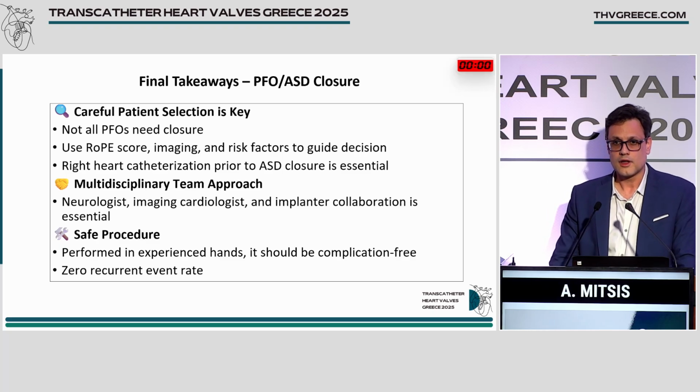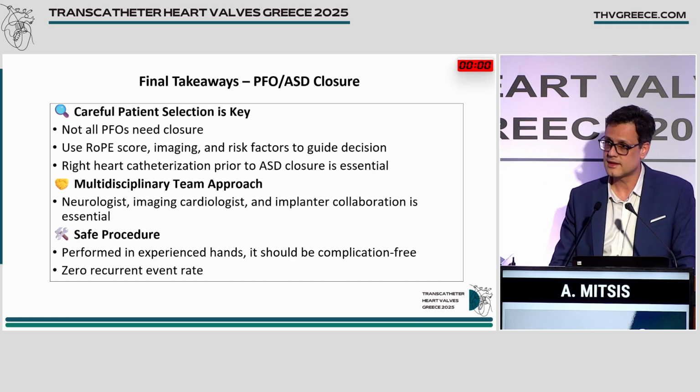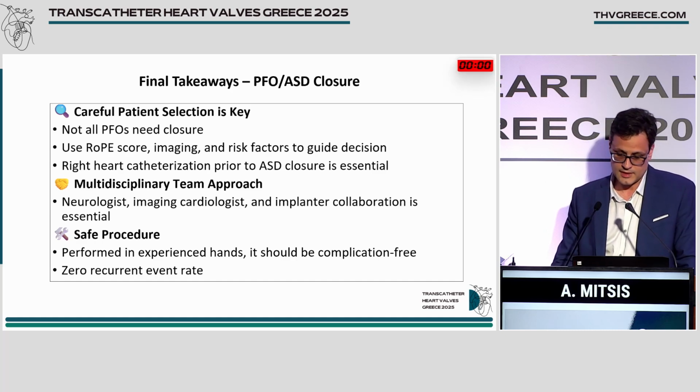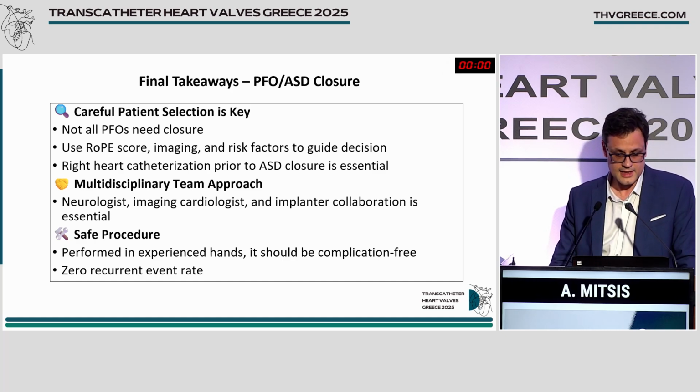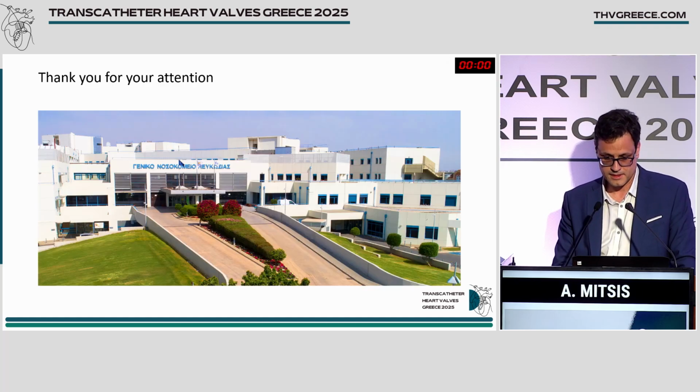In conclusion, these both procedures require a careful patient selection. We have to be able to offer a safe procedure, especially in the patients with PFO closure, and the final selection of the patient should be done in a multidisciplinary approach. Thank you very much.